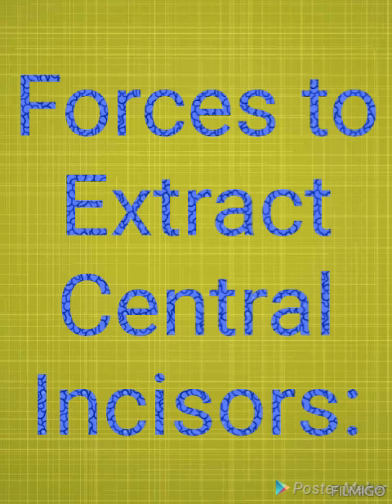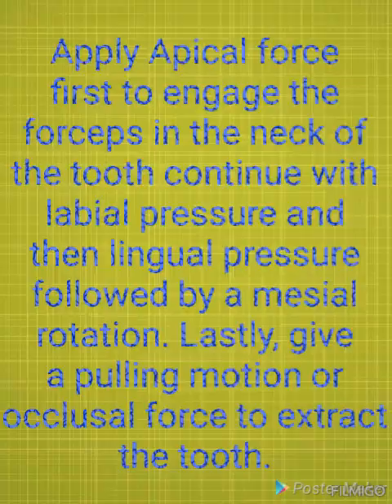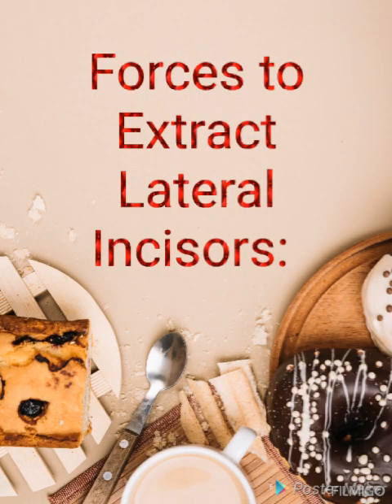Let's see the forces to extract the maxillary central incisor. How will you extract? Apply apical force first to engage the forceps in the neck of the tooth, continue with labial pressure and then lingual pressure, followed by mesial rotation, and lastly give a pulling motion, or occlusal force, to extract the tooth. So mainly for anterior teeth extraction we have to give the rotational movement, and lastly give the pulling force.